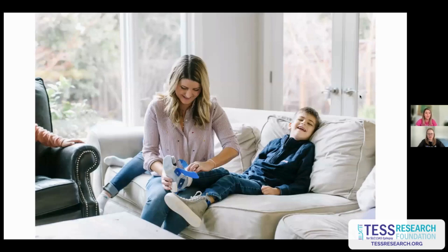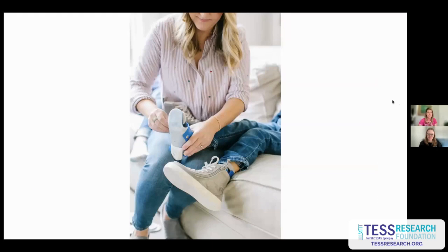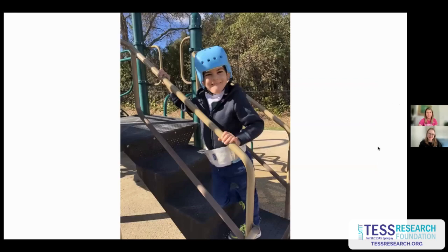And throughout this whole period, he has had supports on his feet and legs. These are sometimes called orthotics or braces. You might hear terms like AFOs or SMOs. There's all different flavors of this, but it's basically to try to help make sure that his foot alignment is correct and that he's learning to walk heel toe instead of walking around on his toes, and to make sure that his knee is in a good position. Again, not a PT, but these are a really useful and consistent piece of equipment for us. And we love our Billy shoes that zip up right around the braces. So a little plug for Billy's and easy footwear when you're using these.